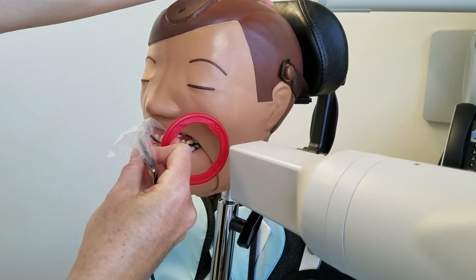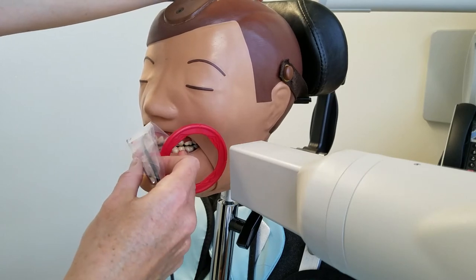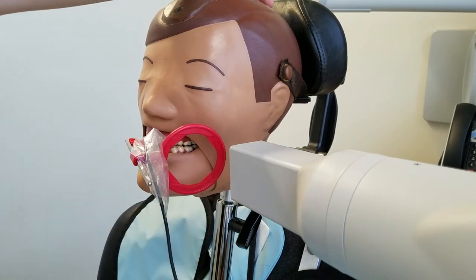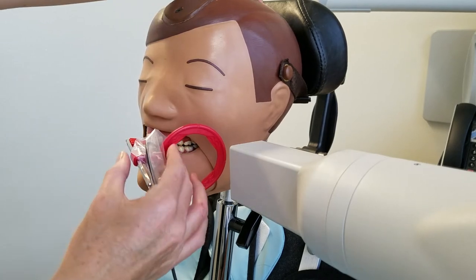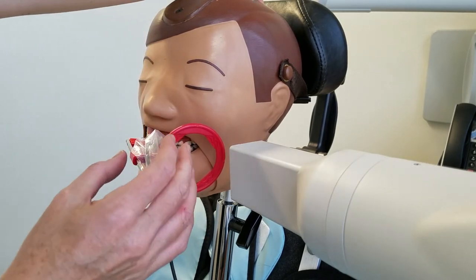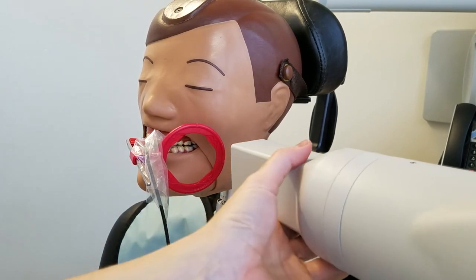I'm skipping the part where we open the occlusion just for time, since I've demonstrated that and it makes the videos a lot longer. We'll address that in lab — I'll help each one of you make sure we get that. So we're going to start with the most anterior film first, make sure that we get the distal of the canine, and then we'll see how many teeth we get in the image.